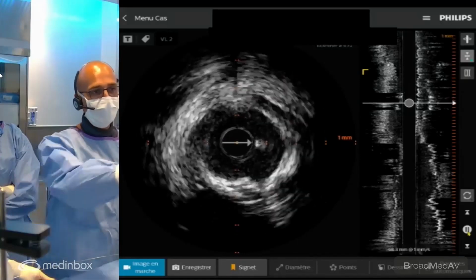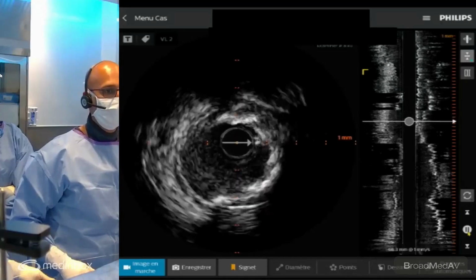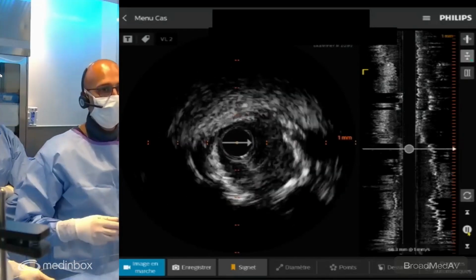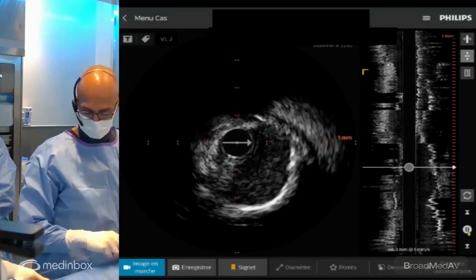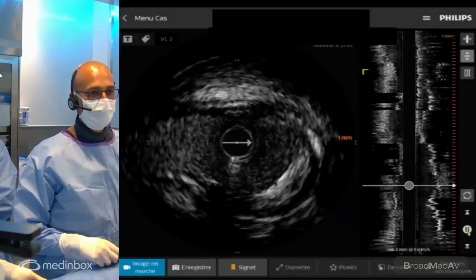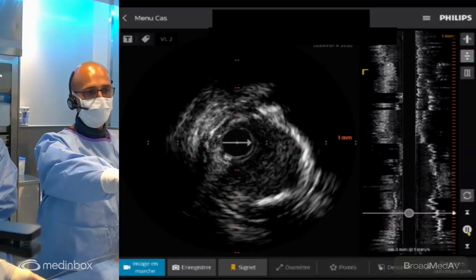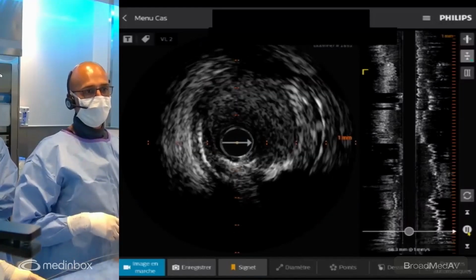Yeah, absolutely. So you see there's a large fracture up top. We don't see that arc anymore. Here we have a 180 arc and there's two segments of fracture. We have much more of a lumen post-ballooning. Same thing here. I think we need to cover that segment. There's some mild disease, but we balloon there. I think we need to cover it. There's some arc, and then we see the healthy proximal segment coming in soon. That's a landing zone. Stop it there.